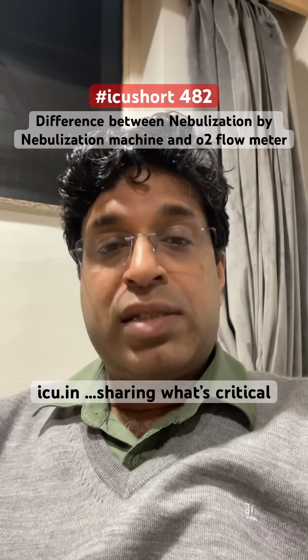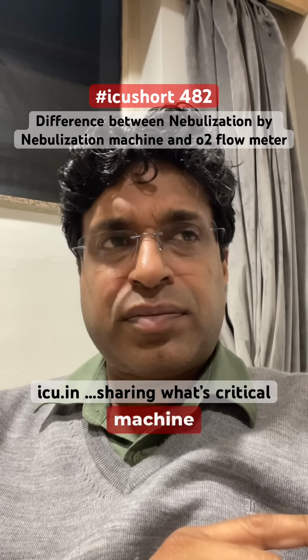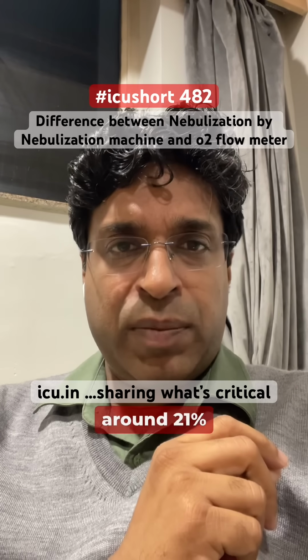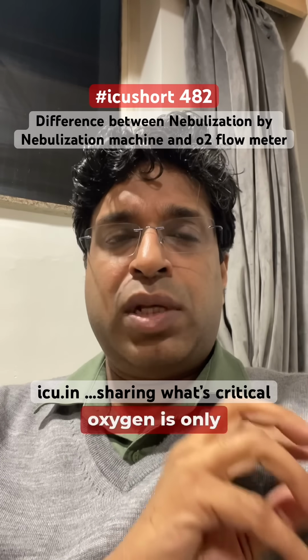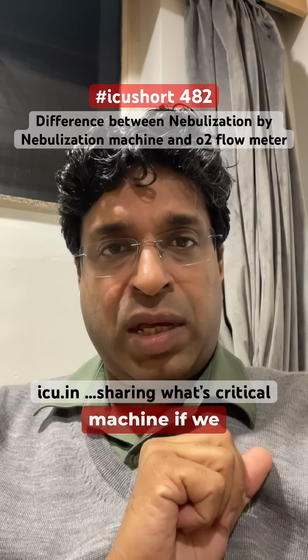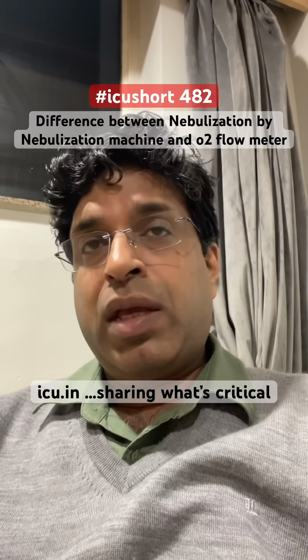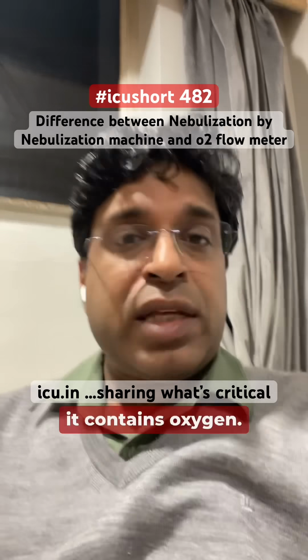nebulization done. Secondly, the nebulization machine is using the atmospheric oxygen, which is somewhere around 21%, and that much oxygen is only present in the nebulization machine if we are giving the nebulization. While the O2 flow meter which we are giving contains oxygen. So you understand that 6 to 8 liters or more flow, like 10 liters per minute, oxygen is coming. So it provides more oxygen to the patient.